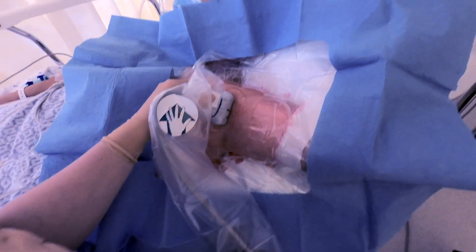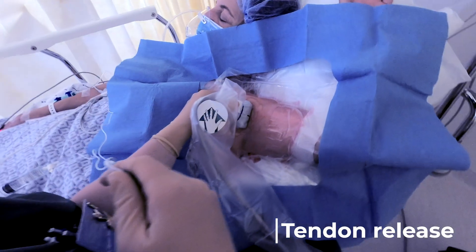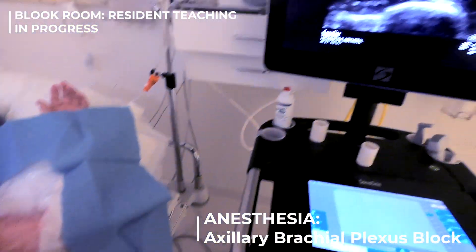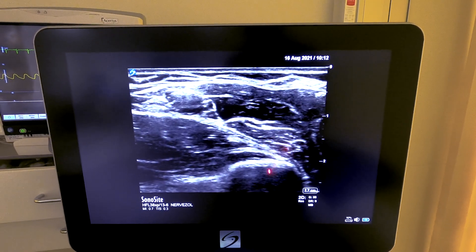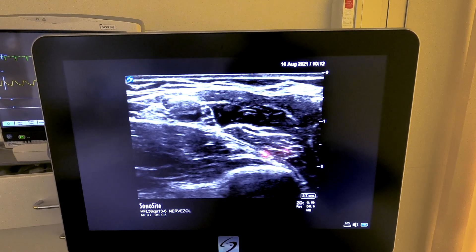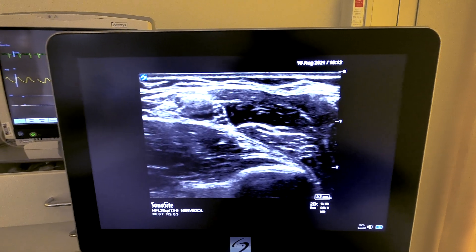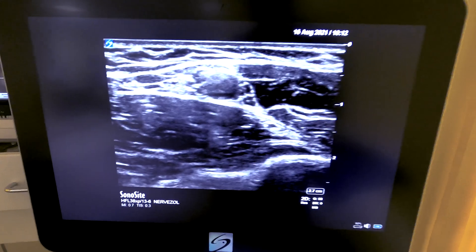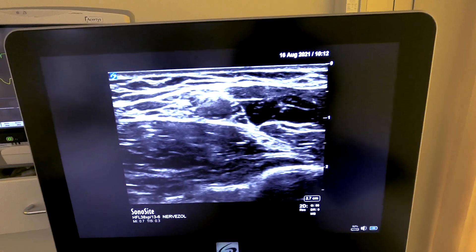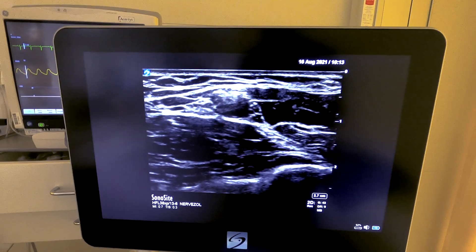We have a patient scheduled for tendon release of the thumb, and we're going to do an axillary brachial plexus block for this operation. As we look at the ultrasound image, what you can see is the humerus, the conjoint tendon, and the axillary brachial plexus sheath. The first thing we want to focus on is what is actually the strategy to accomplish this block.